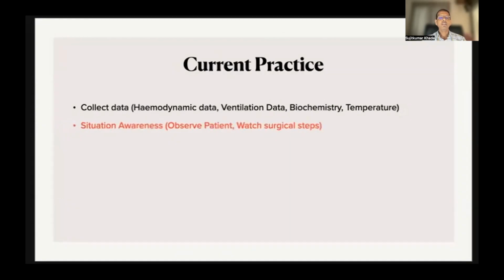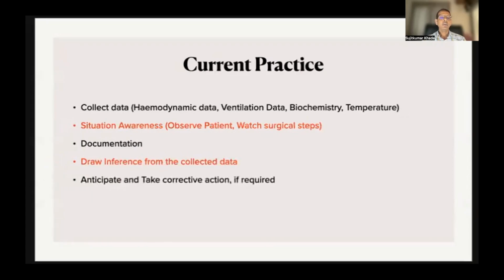We need to have situation awareness. For that, we observe the patient and watch surgical steps. At the same time, we need to document hemodynamic parameters and steps of surgery and anesthesia. We draw inferences from the collected data. We anticipate the adverse events and take corrective actions if required. And at the end of the surgery, we see that the patient lands safely in a conscious state.